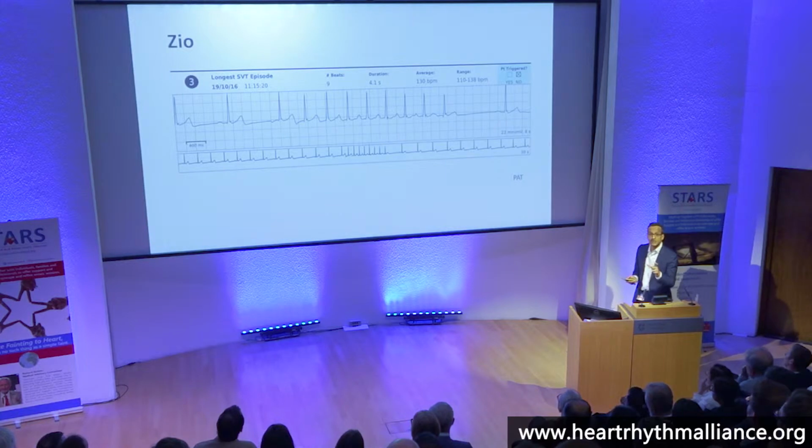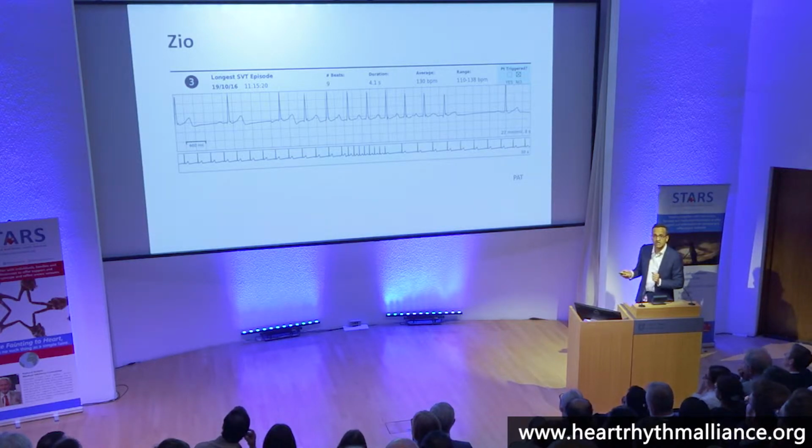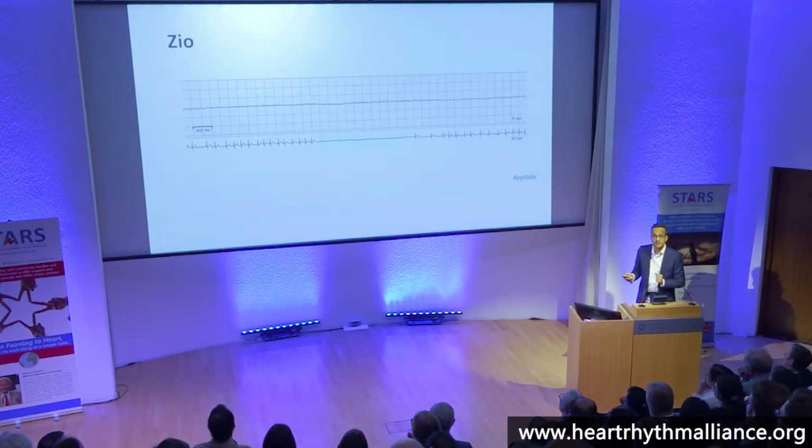This is a very prime example because of Nick's very flat, hairless chest, yes? Ladies. So you can see a discernible P wave morphology here, but sometimes you're just not able to see it. There are others on the market now which have better P wave discrimination, but in patients with syncope, you don't really need that. All you need to see is this, and it's very good at it.